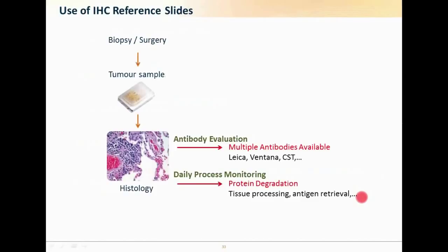I've summarized in a similar way to the FISH how you could use reference slides. So very much for antibody evaluation: who do you get your antibody from? Which clones you choose? Which ones work using your standard protocol? And also for daily process monitoring, so ensure that the tissue is being processed correctly, that the tumor sample is being treated as delicately as possible, and that you're able to perform antigen retrieval for good staining.